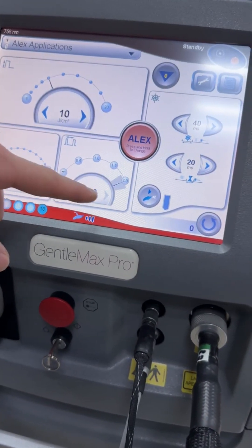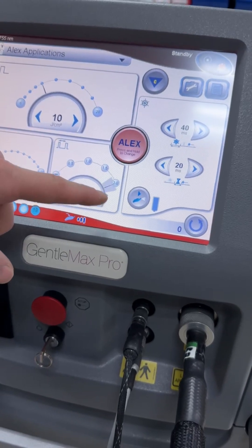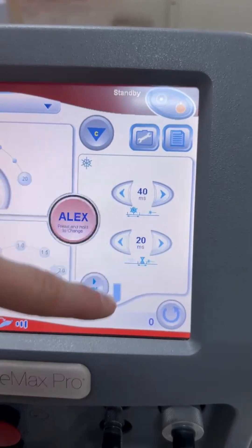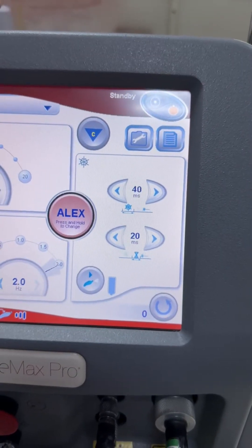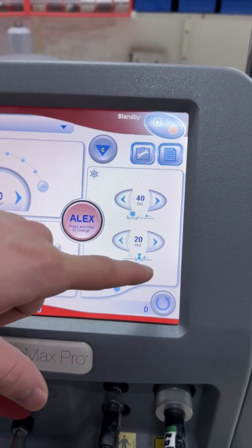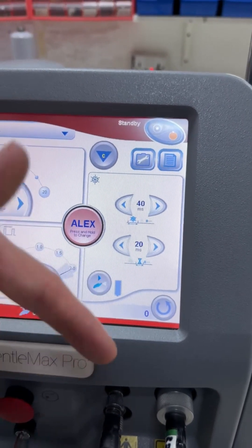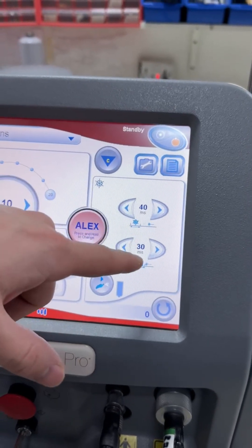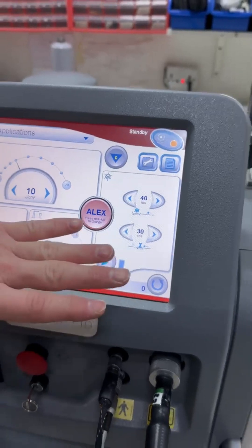The right option is to control the lasing speed. The right section lets you control the DCD gas flow and speed. The top option controls the amount of gas coming out each time you lase, and the bottom option controls the speed of the DCD gas flowing. The standard values for the DCD gas options are 40 and 30.